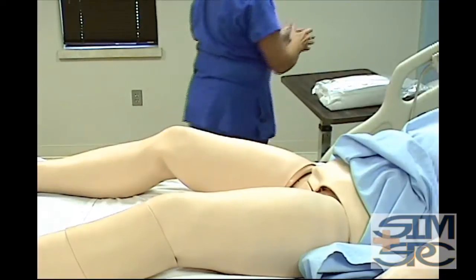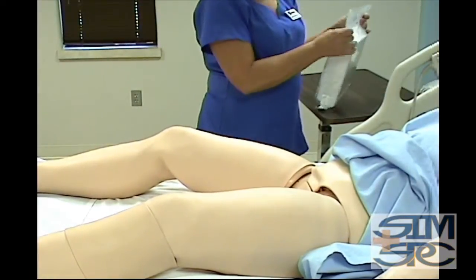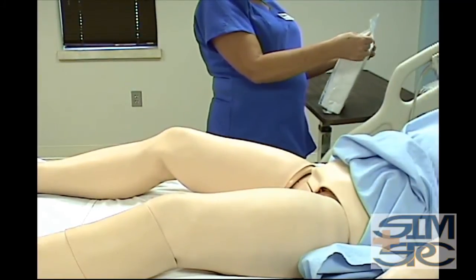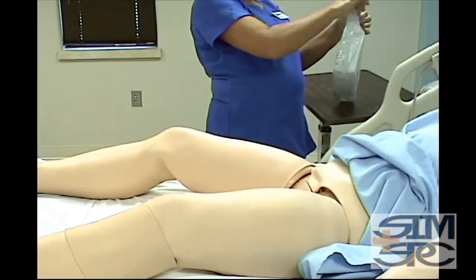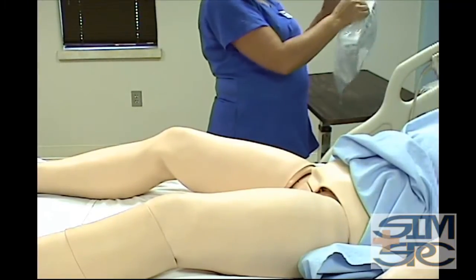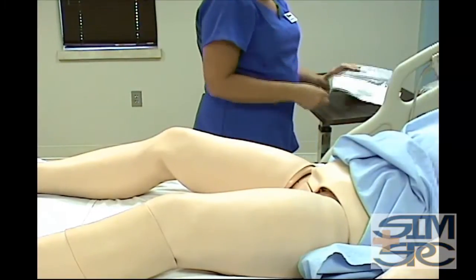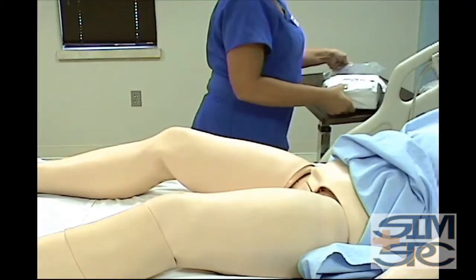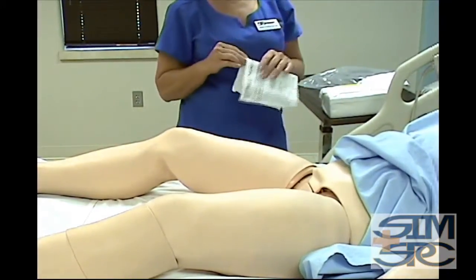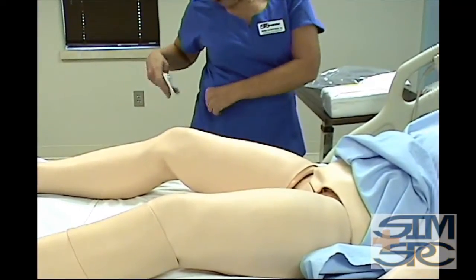Okay, now I'm going to wash my hands again before I open the package. Now we can go ahead and open the package. And usually there is a little perforated place so that you can tear it. A lot of times you can go ahead and keep this. It gives you the information on your Foley. And it's a 14 French, so you don't forget to chart that.